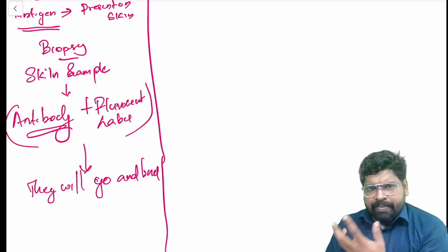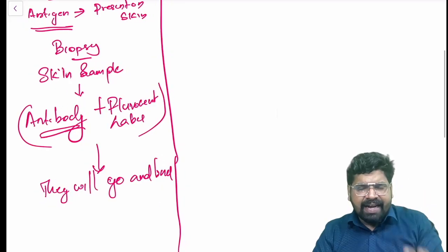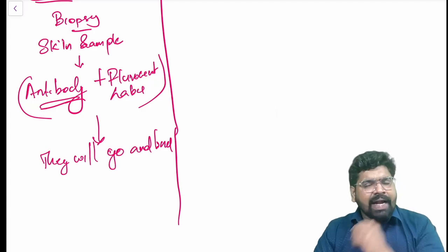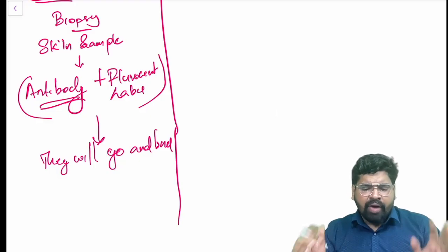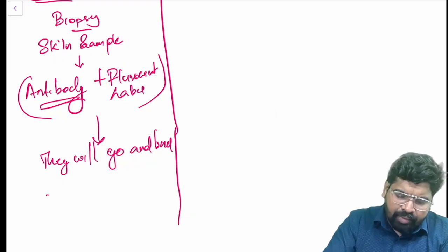When will it bind? Only if there is an antigen. Only if the desired antigen is there in the skin will the antibody go and bind. If that antigen is not there, it will not bind. So I put this there. If there is antigen, they will have an antigen-antibody reaction.